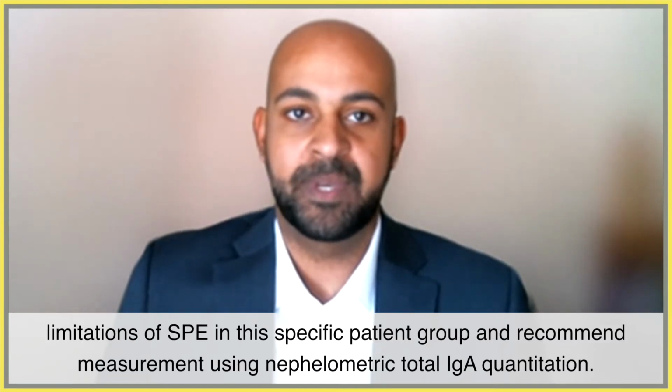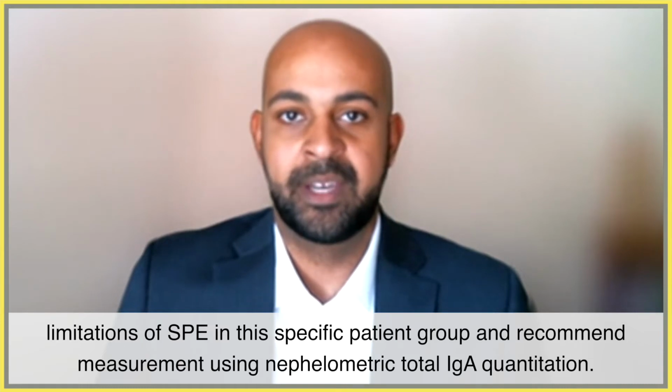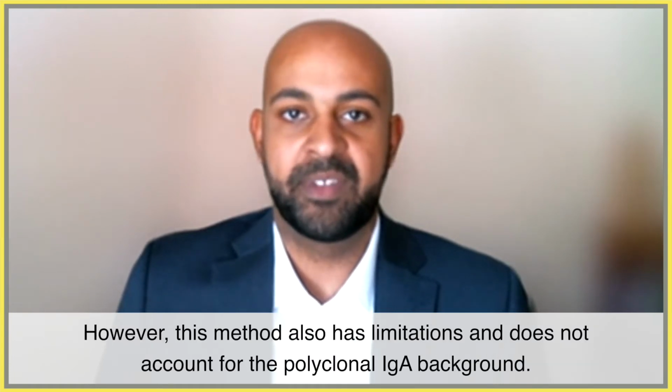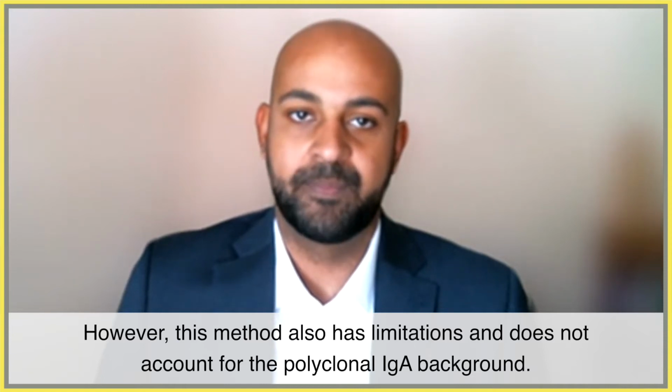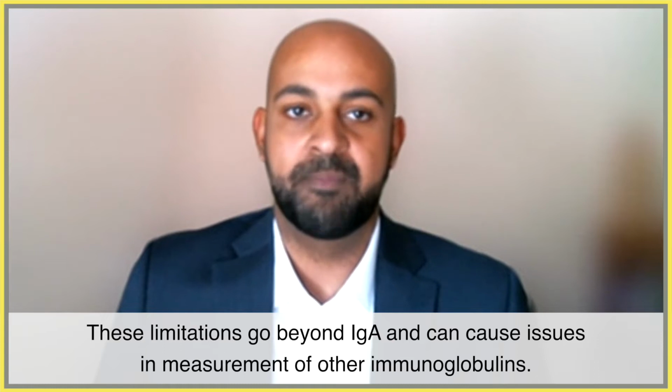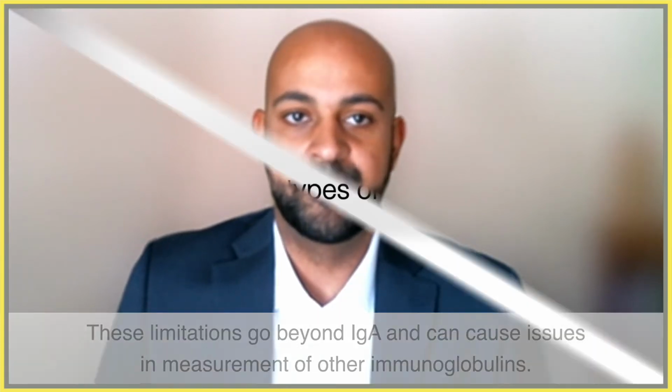As discussed in our first video in the series, the International Myeloma Working Group, IMWG, has recognised the limitations of SPE in the specific patient group and recommends measurement using nephelometric total IgA quantitation. However, this method also has a limitation and does not account for the polyclonal IgA background. These limitations go beyond IgA and can cause issues in measurement of other immunoglobulins.